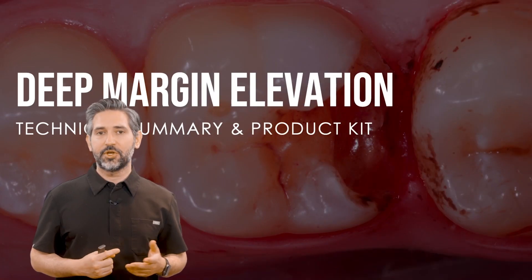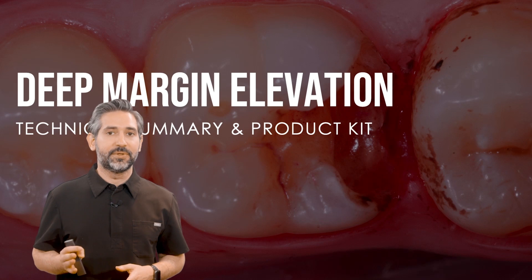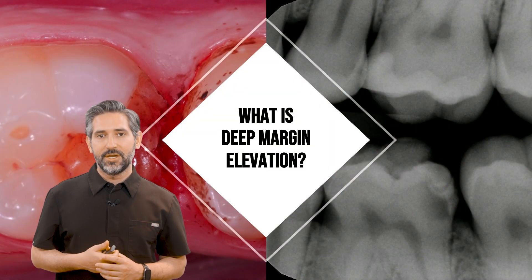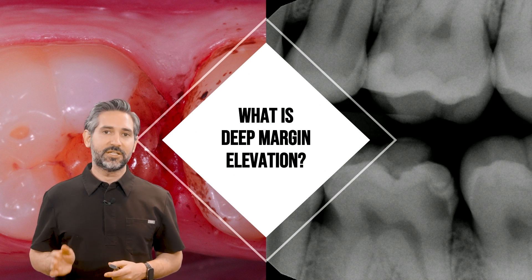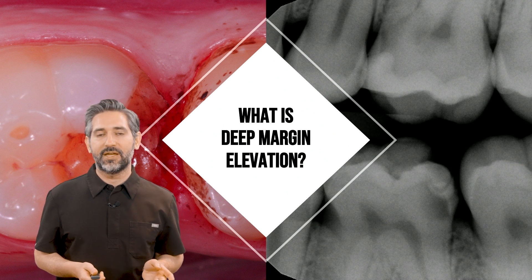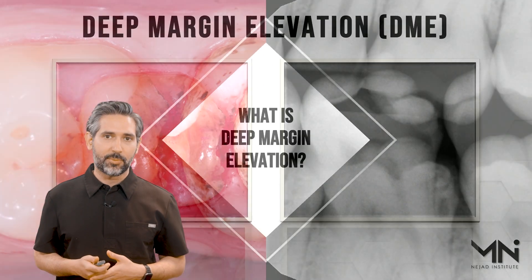In this video we're going to be covering the deep margin elevation technique and some of the different materials I use to manage even the most difficult situations. There's a lot of confusion about what deep margin elevation is, and that's part of the problem, so it's very important to have a good understanding of what deep margin elevation is and how it can be used properly.